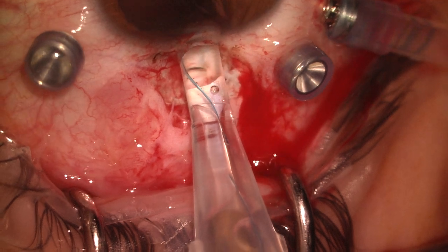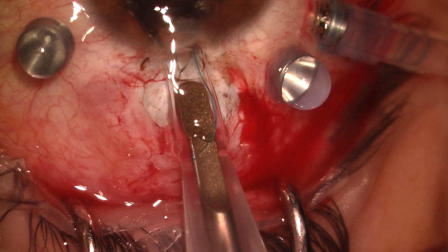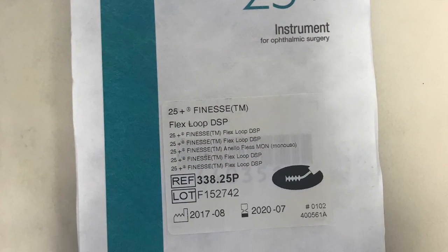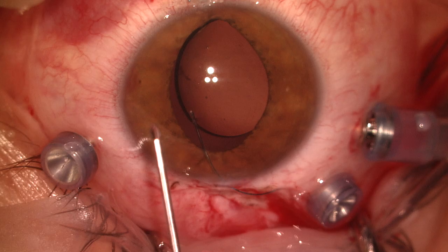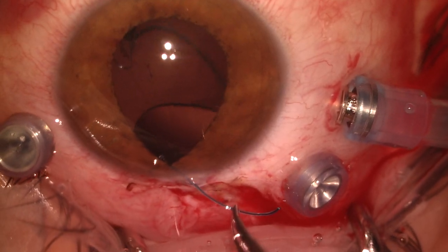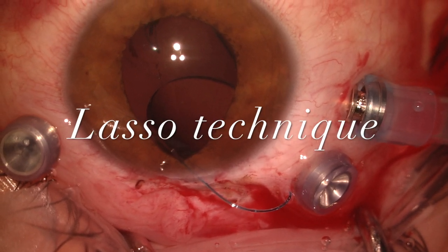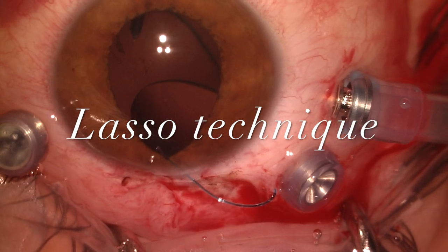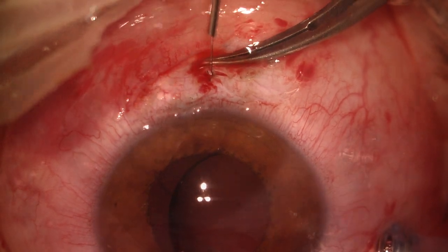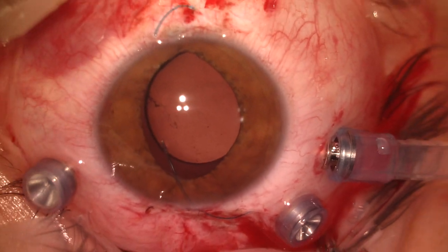A 3-piece implant is inserted through a 3 mm corneal incision. The Flexi-Loop device facilitates the prehension of the lens haptics, which are guided by the surgical forceps.